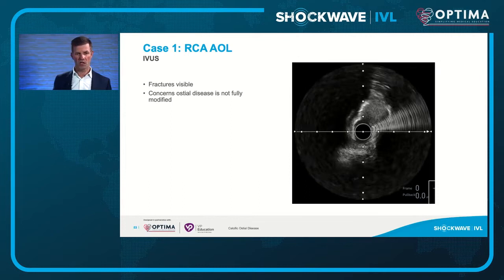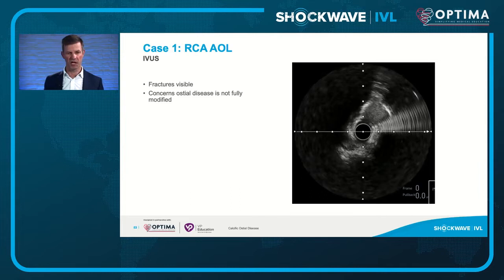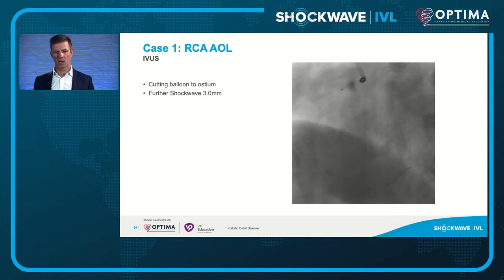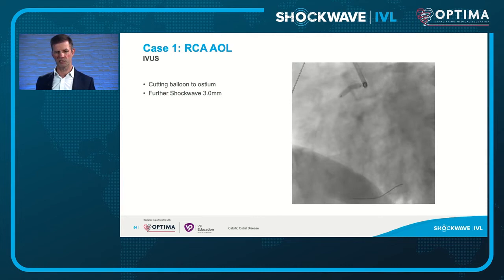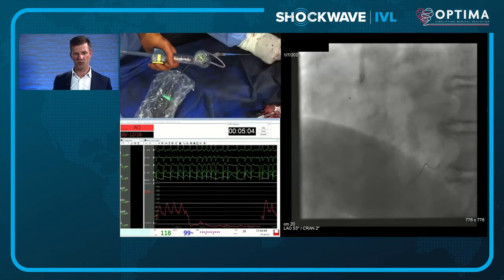On re-imaging, there are visible fractures, but I'm still concerned that I haven't disrupted the ostium enough or modified the osteal disease sufficiently. I use a 3 by 15 Wolverine cutting balloon, and with inflation there's a suspicion of a more proximal waist. Shifting to a spider view and then an LAO caudal position, it's more obvious there is a waist. I then use a 3 millimeter shockwave balloon deployed at the ostium, delivering around 40 pulses.